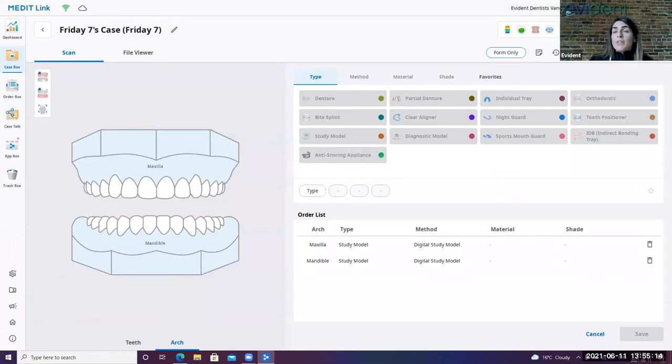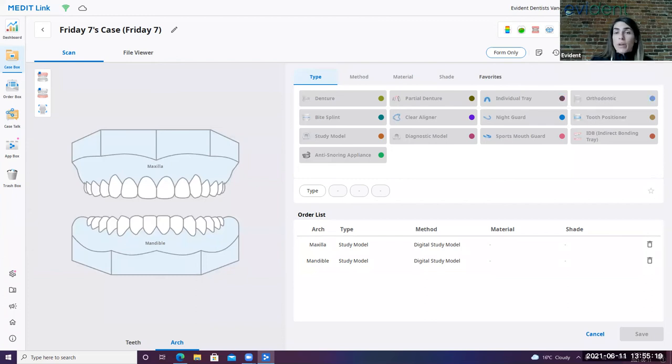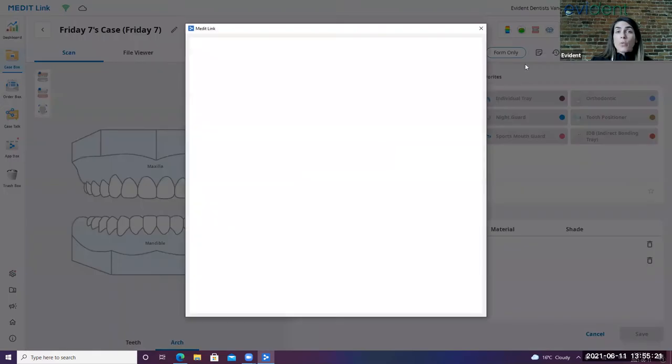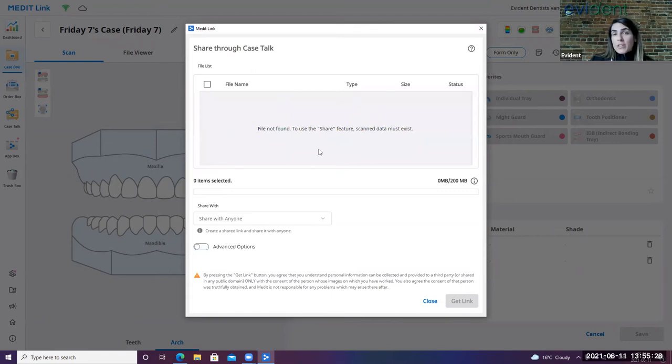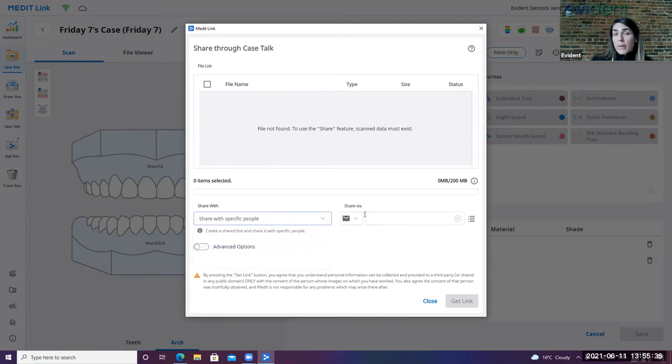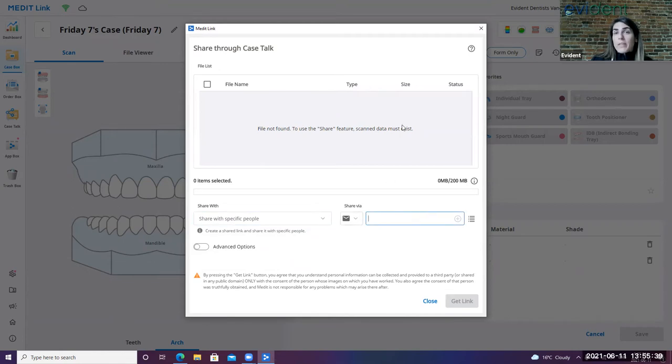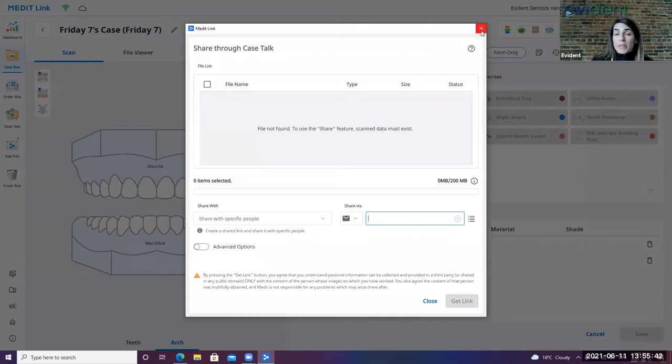This button here is that case talk that I had mentioned when we were in the case talk action button. So this is where you would go ahead and share the scan with a patient. Simply just click on the button here. If you do have a scan, you will actually see the information here relating to the scan. And then you have the opportunity to go here and select, share with specific people, but via email, include the email address, and then you get the link. And then they get notified on their side that they do have something there to view.